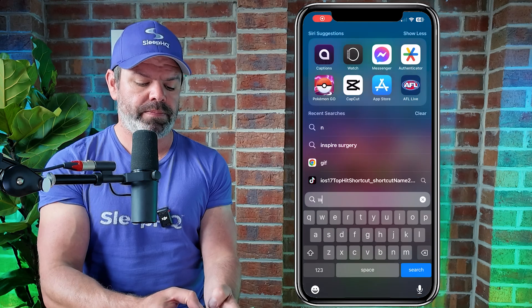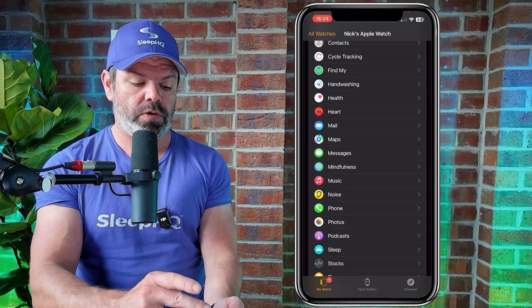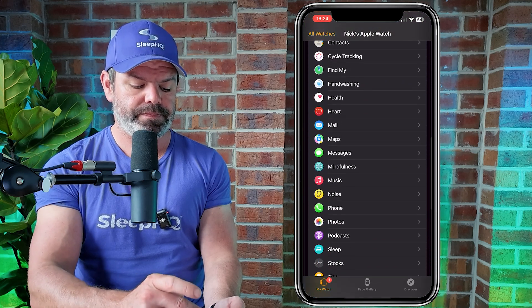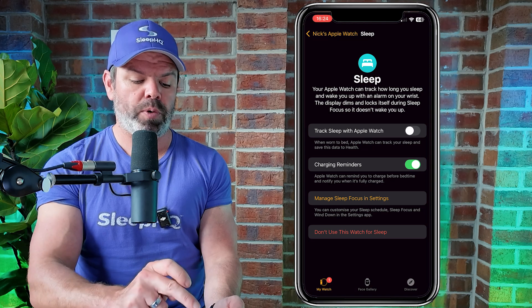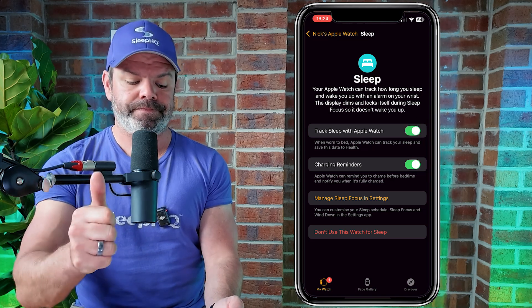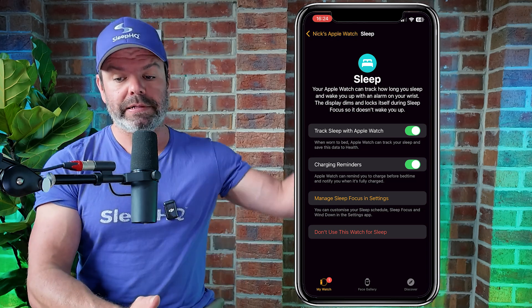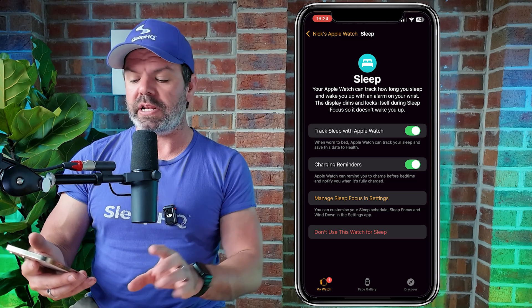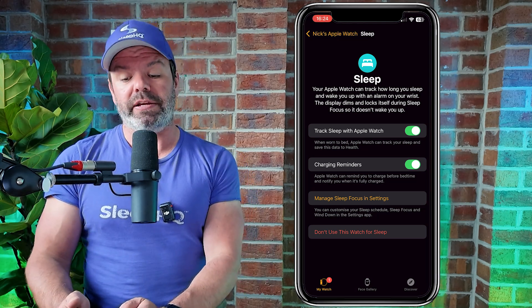Open up the Watch app, then scroll down to Sleep — here it is — and then toggle on 'Track Sleep with Apple Watch' and you're good to go. You can manage other settings as well; I've done a whole video on Apple Sleep — click the link above if you want a detailed explanation of all the different settings you can tweak. But that's basically how you do it, so that's number three.